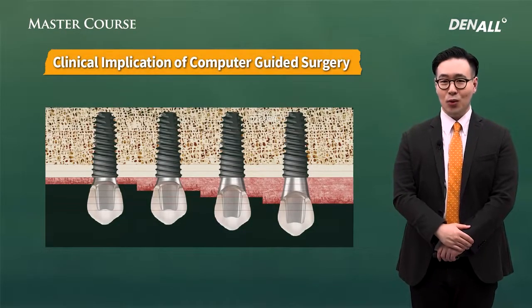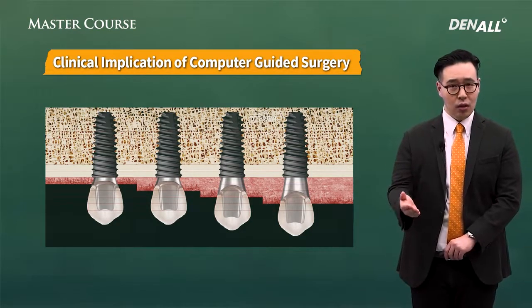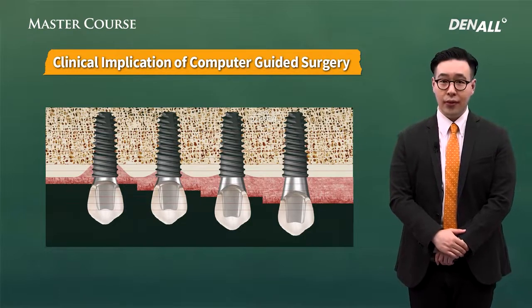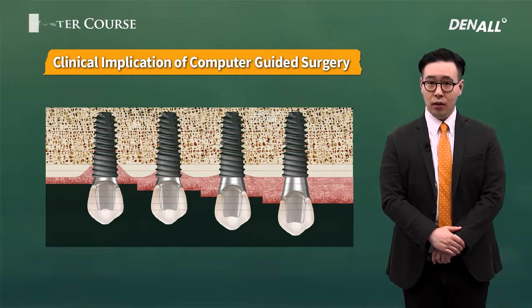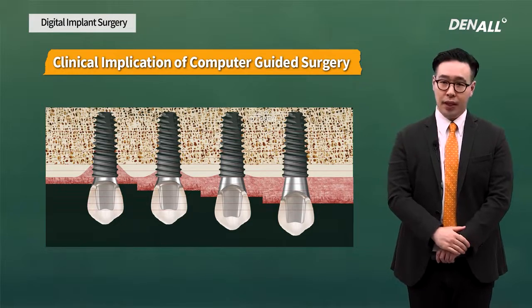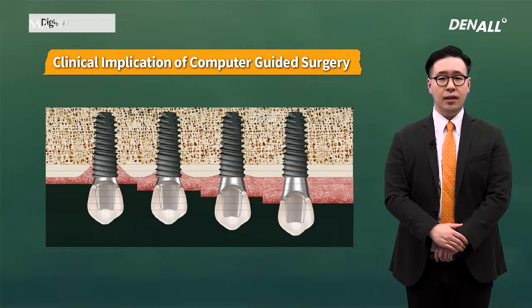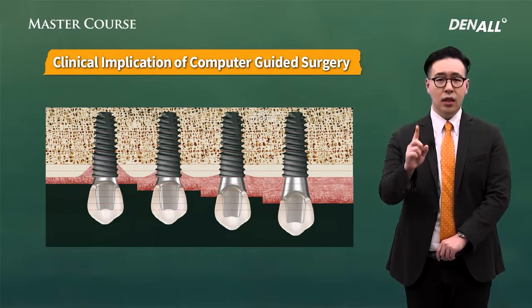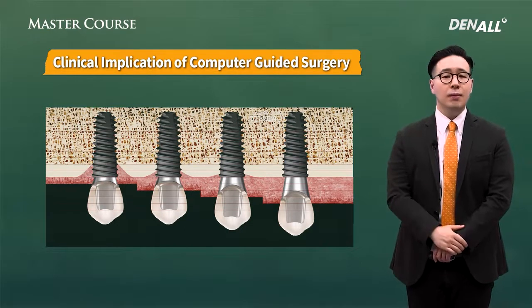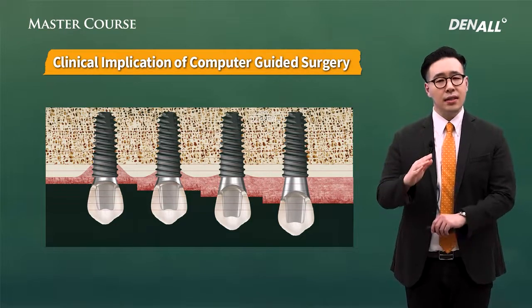So, if the thin soft tissue is not properly identified and the implant is placed aligning with the bone surface, as soon as the healing abutment or temporary prosthesis is connected, biologic width kicks in, causing bone resorption. This should be remembered. The first rule is to place it 1 millimeter deeper than the bone surface. The second rule is to calculate the soft tissue thickness. Clinically, when busy, this is frequently overlooked. That's the big difference.